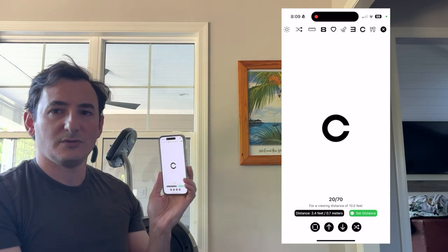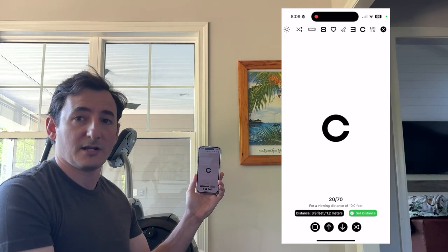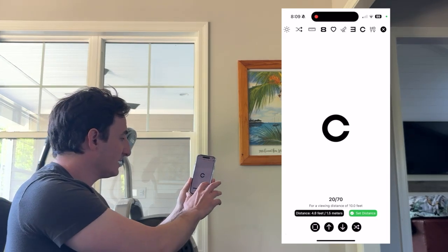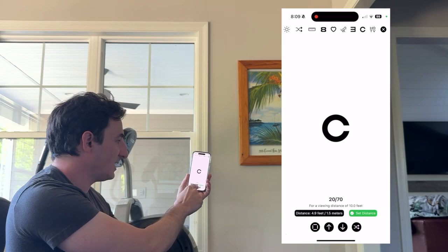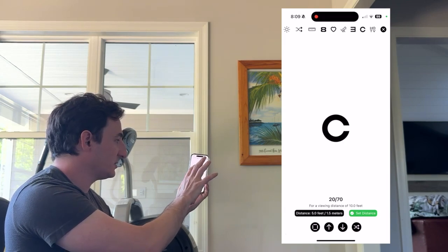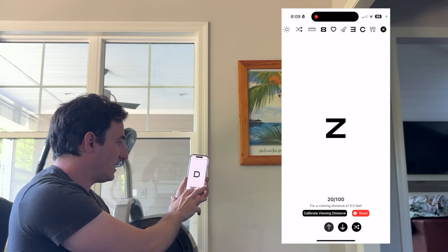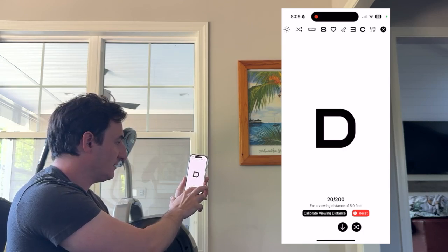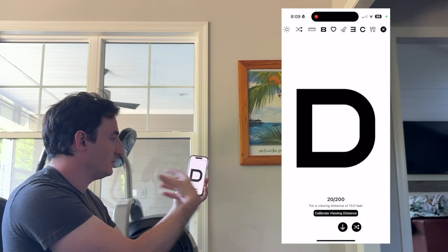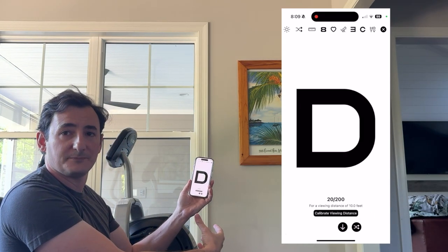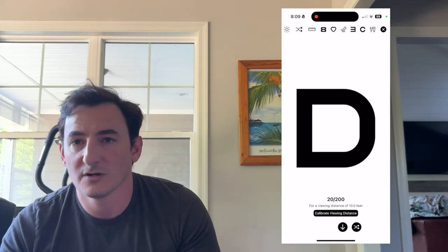Once you move to your desired testing distance — say you're at a chair and want to test further out — you press 'set distance.' Right now it's at 10 feet, so the optotype shrinks in half. It now shows a viewing distance of five feet, and if you press reset you'll go back to a viewing distance of 10 feet.